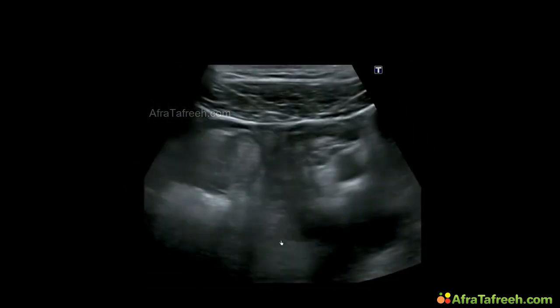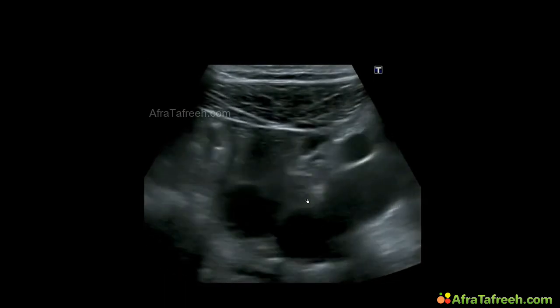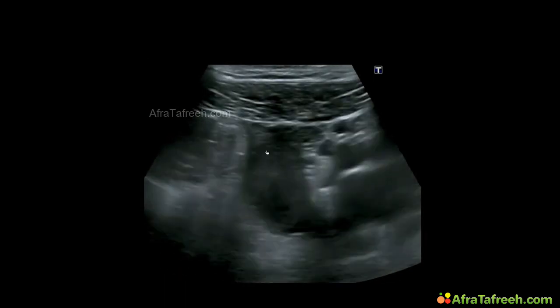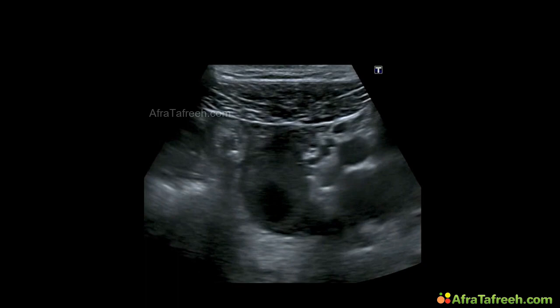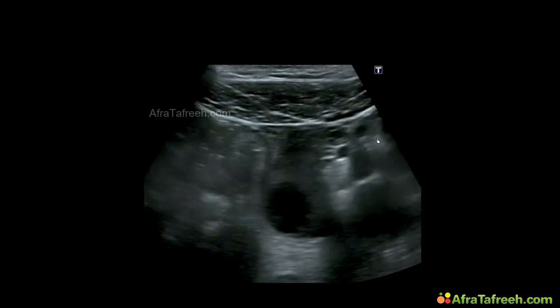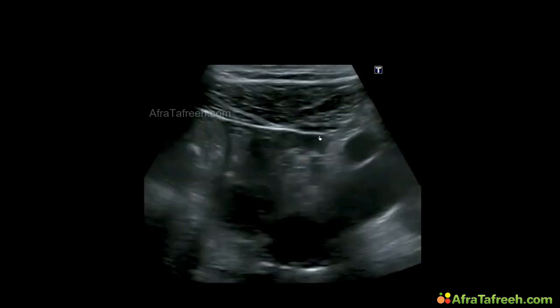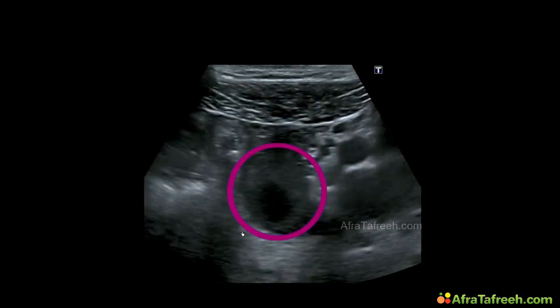In this particular case, we used a linear probe to get a better resolution in the near field, and we can easily detect this oval-shaped ovary over here with an up to 1.5 centimeter cyst in this area. And once again, you will detect iliac vessels on the lateral side of the picture and the ovary over here.